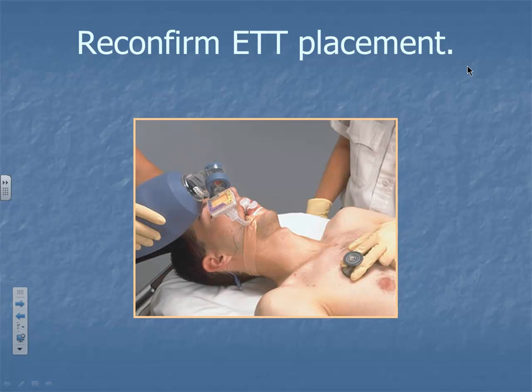When else should you check that? Anytime you move the patient, you have to recheck that. Consider, say, that your balloon in there got a little hole in it and it's collapsed. If that happens, the slightest little movement can displace your tube. So anytime you move them, there's one other time where you absolutely have to check it. Anybody have any ideas?